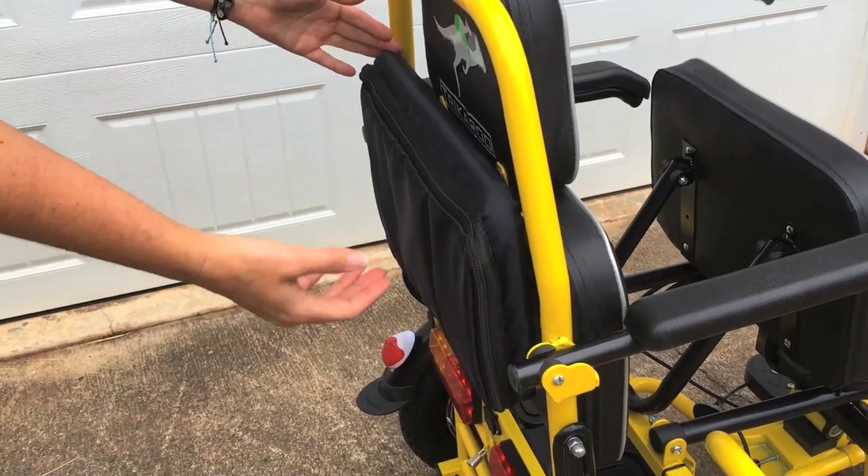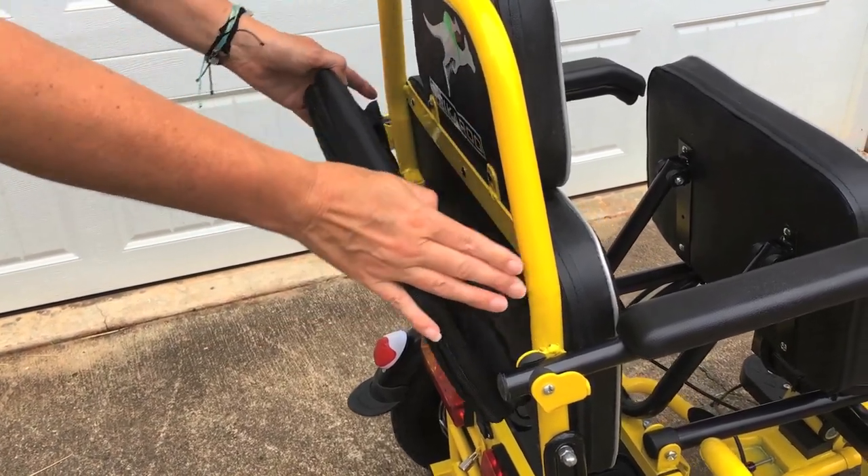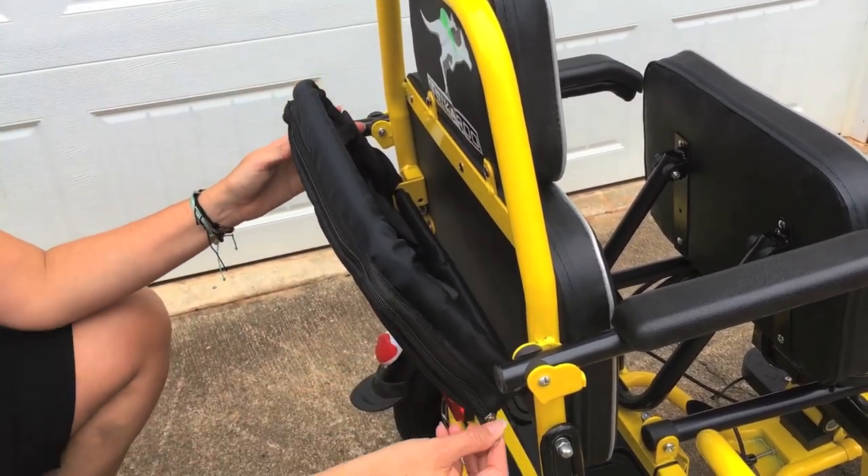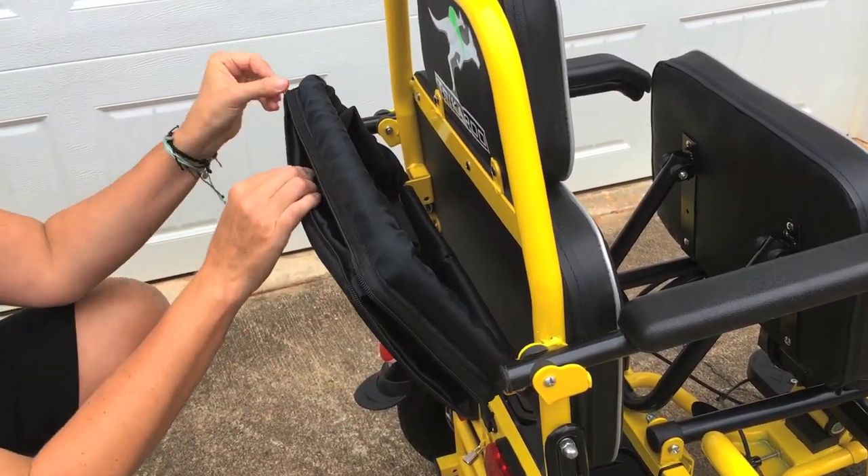On the back of the flyer you've got extra storage — we like to call it a pouch. To make this expand, you just unzip it, similar to a suitcase.